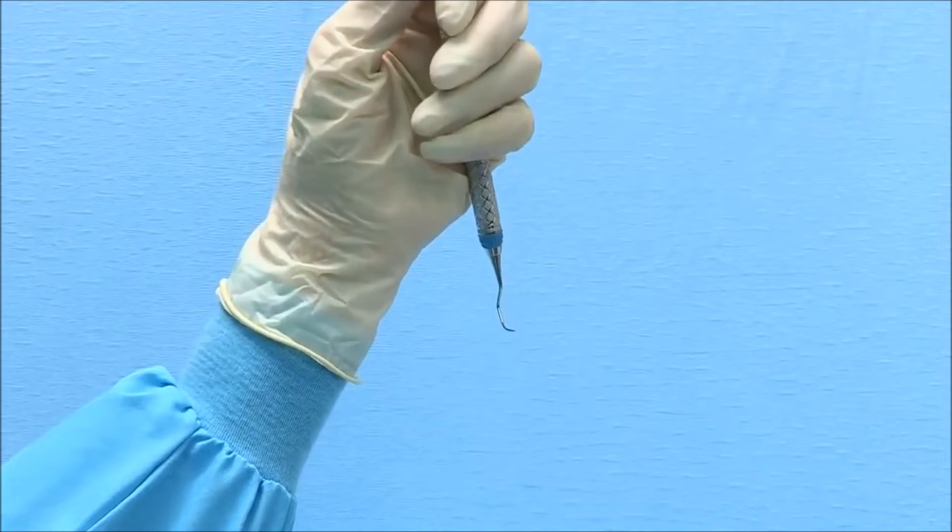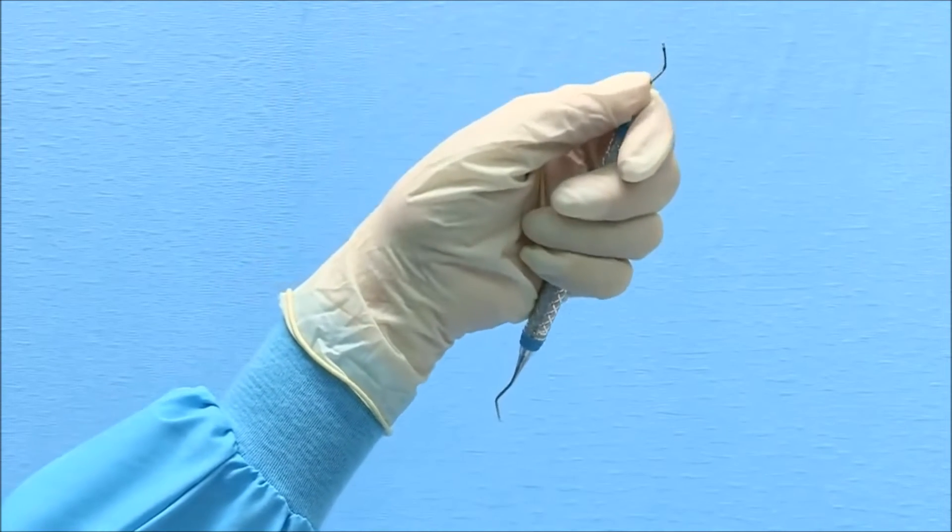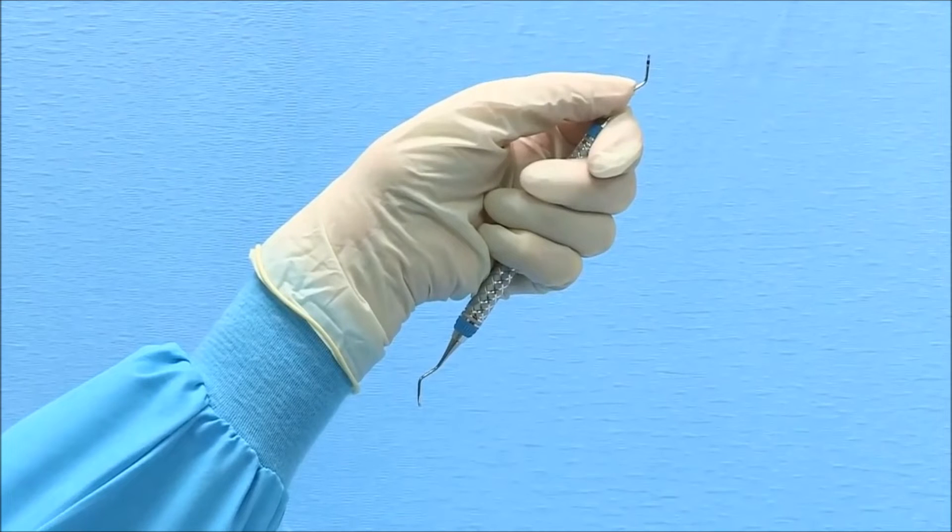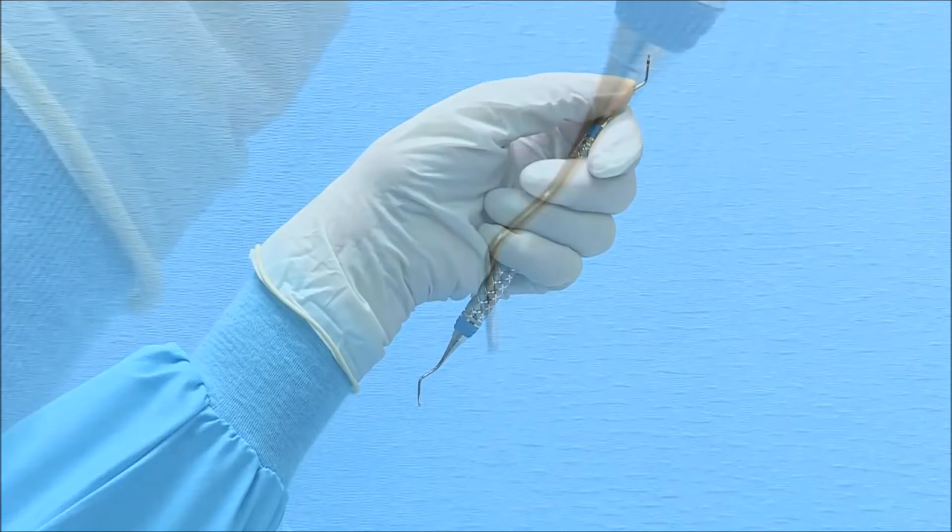To sharpen the opposite cutting edge, rotate the instrument so that the toe is pointed away from you. Maintain the secure palm grasp and brace the top shank with your thumb with your elbow on the table in front of you.